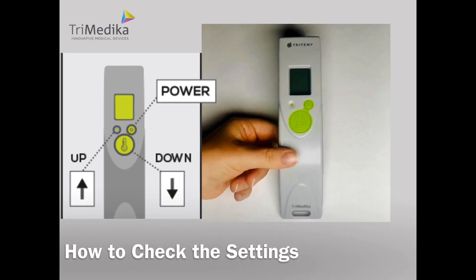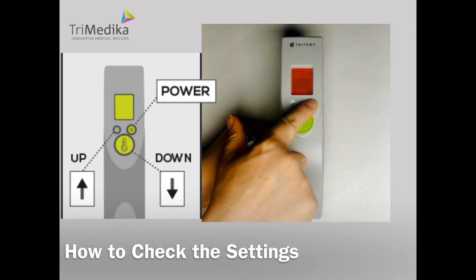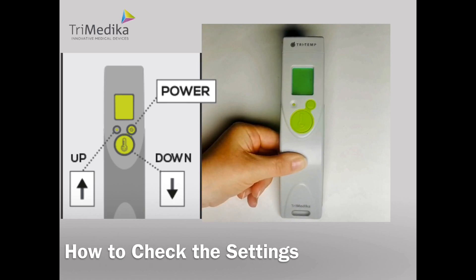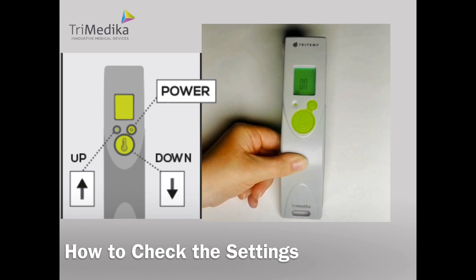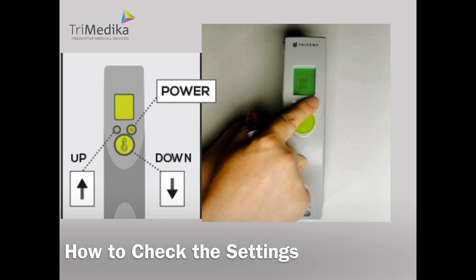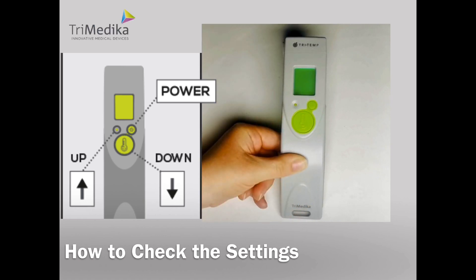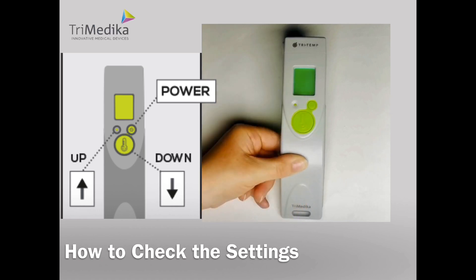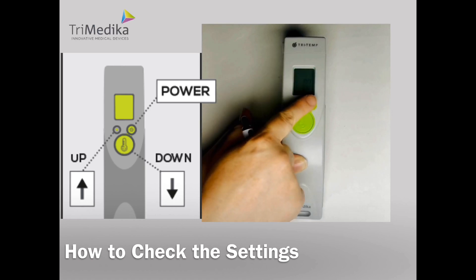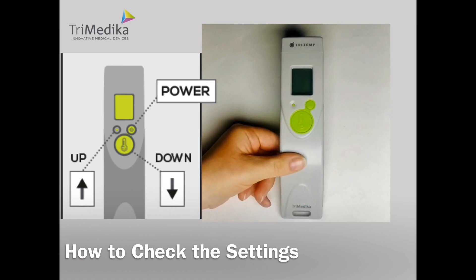To simply check the settings, press the power button until it beeps. Press OK to remain on Celsius, press OK for audio on, press OK for the body setting, and press OK if the offset is at 0.0. You have successfully checked that the settings are the approved settings.